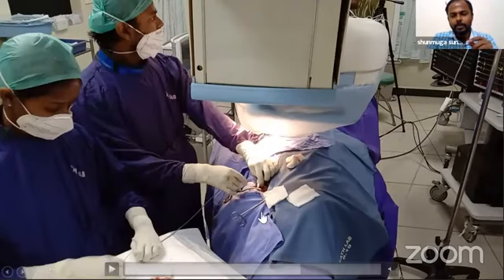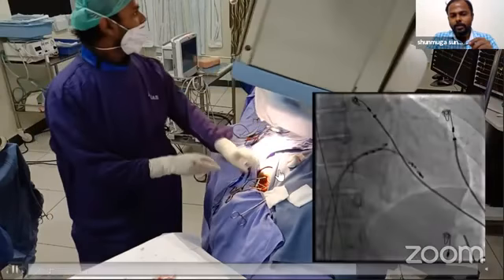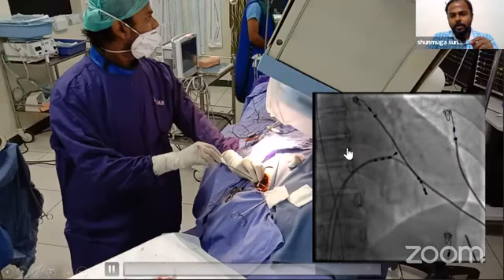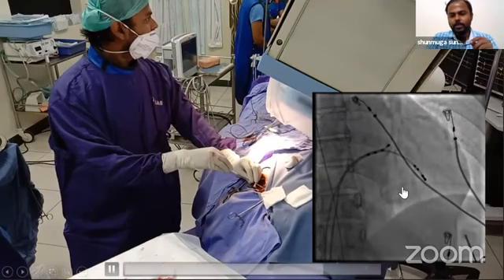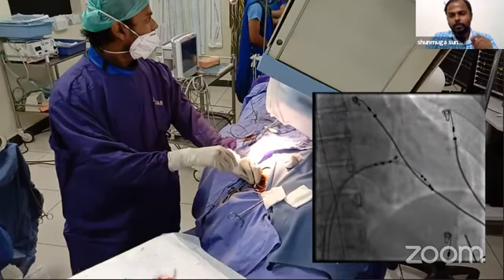So I'm just putting the sheath in. So you can see here, once the sheath is in, till this point, the procedure is almost the same, like doing a His bundle pacing. So in His bundle pacing, your sheath will go to this His bundle zone and you will start mapping and screw the lead wherever you are getting a good His signal as well as the ventricular signal. But here in left bundle pacing, you have to take the catheter from the right atrium and go into the ventricle. So this is the first thing which differentiates His bundle pacing from left bundle pacing.